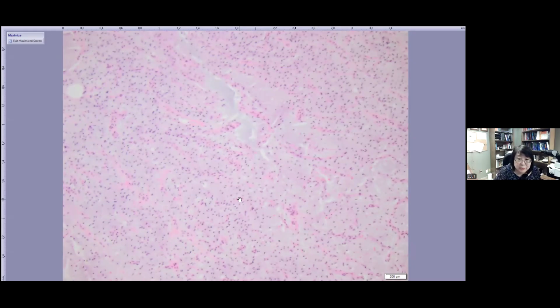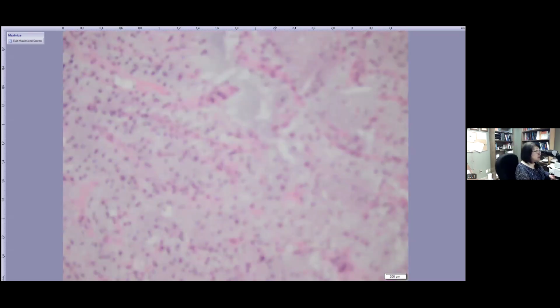I think those pink areas are vessels, thin walled, angulated. Sometimes we describe this as chicken wire vessels, angulated chicken wire vessels. So in a 17-year-old with a soft tissue mass with this kind of morphology, take a close look at the cells.